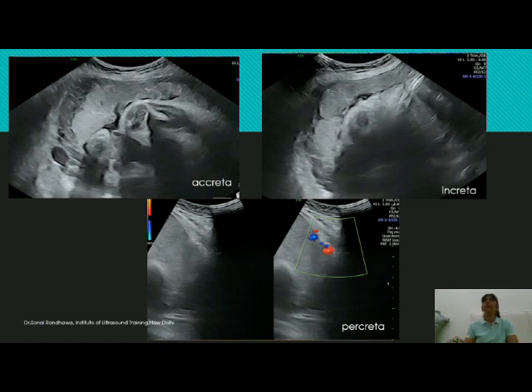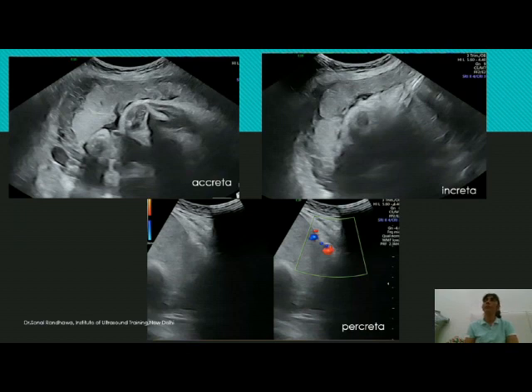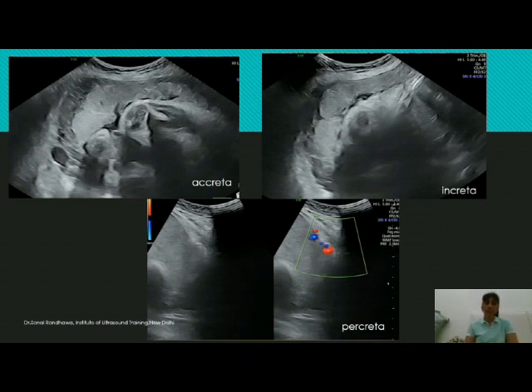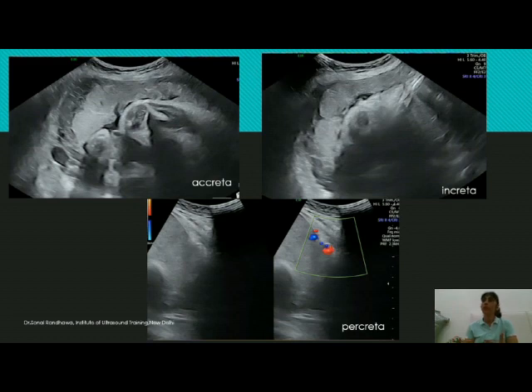Wherever there is invasion into the myometrium by placental tissue, it will invade the vessels, and this will increase color flow. To distinguish abnormal from normal retroplacental flow, apply color in an area where the retroplacental space is clearly visible and compare it to an area where the retroplacental space has disappeared. There will be a difference in color flow — it will be greater in the area of increta or percreta where placental tissue has invaded the myometrium.